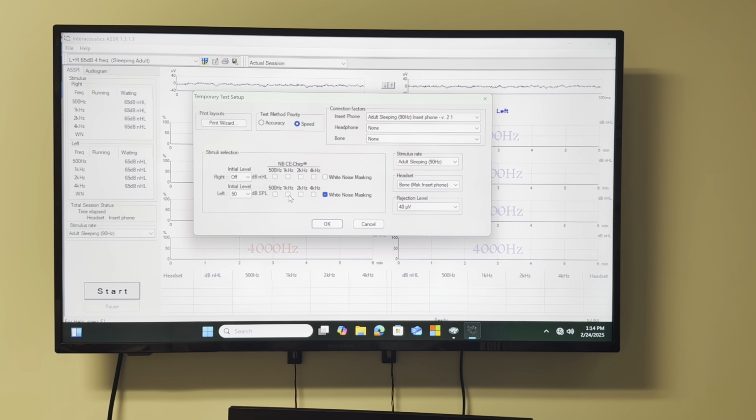Then you have to select the decibel level, so you play noise plus 30 dB. I think we discussed bone conduction masking last semester with the ABRs. You play 30 dB higher than the test tone for the ABR. You can go at 40. I want to show you some artifact problem with the bone conduction, so don't play any noise now. Just select all the frequencies, just put it off.